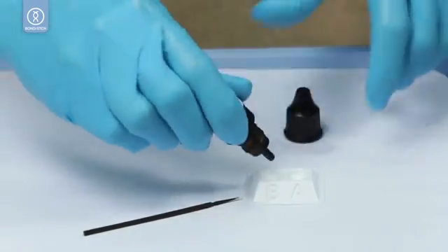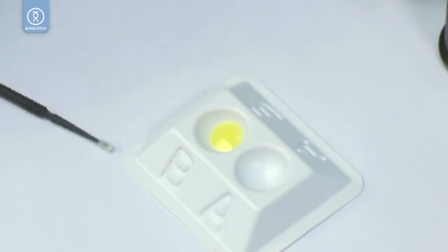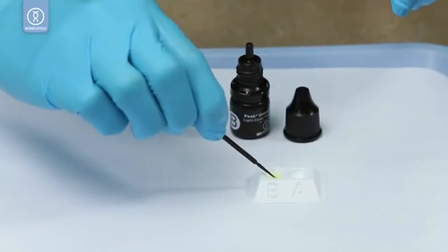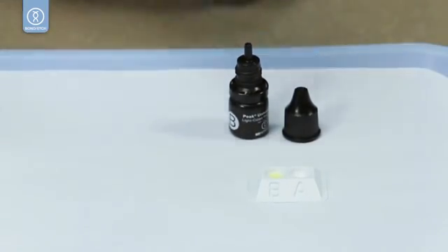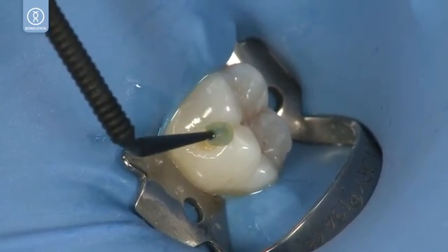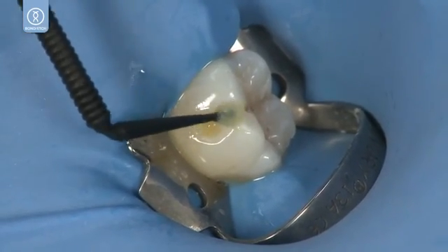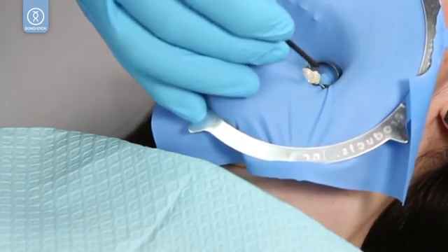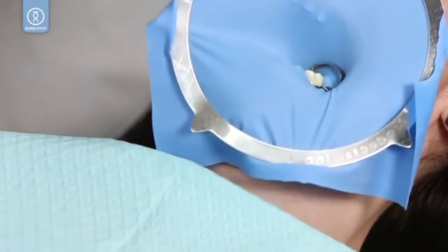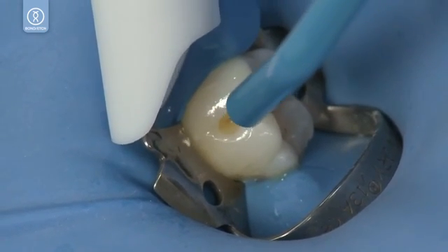Place 1–2 drops of Peak Universal Bond into the well and load the micro applicator brush. Apply Peak Universal Bond and gently scrub the dentin for 10 seconds. Thin and dry at half air pressure for 10 seconds.